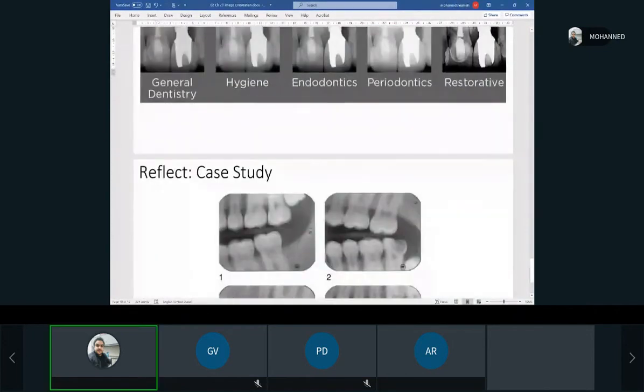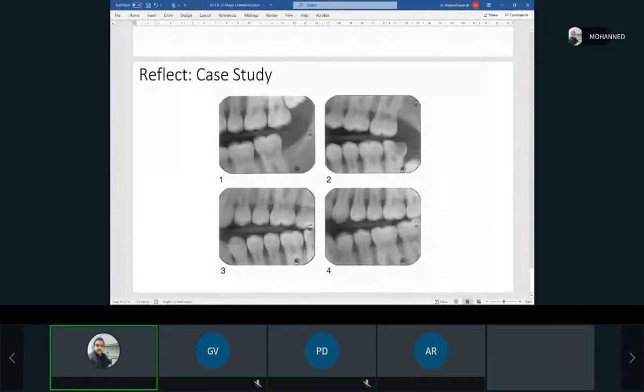This just shows you, for example, is image number 1 mounted correctly? Is it backwards? Is it upside down? Yeah, it's correct. We have mandible teeth here, two roots, and the mandibular arch going up.